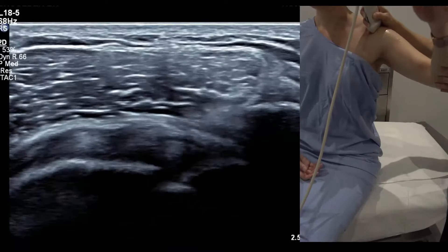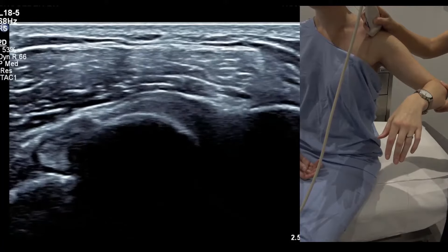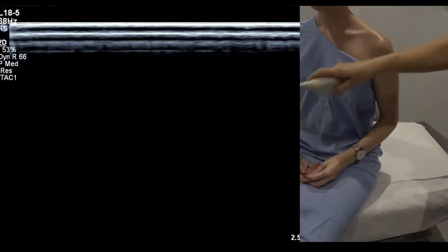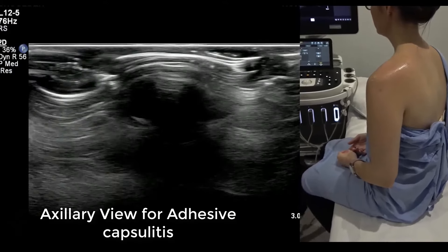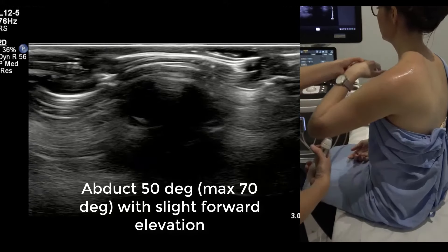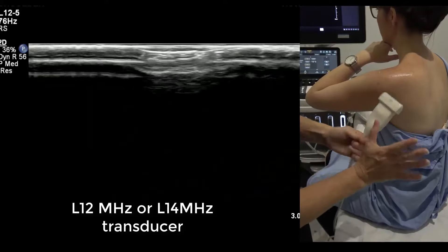That's another clinical sign of adhesive capsulitis. For adhesive capsulitis we do the posterior glenoid view, but also this view of the inferior glenohumeral ligament. Bring the patient's hand just to their chin — that's about all they're capable of if they have it. This little fold on the humerus, line up with that.